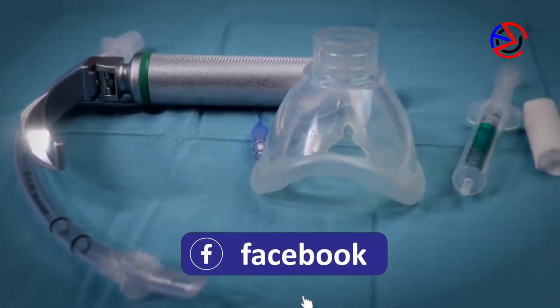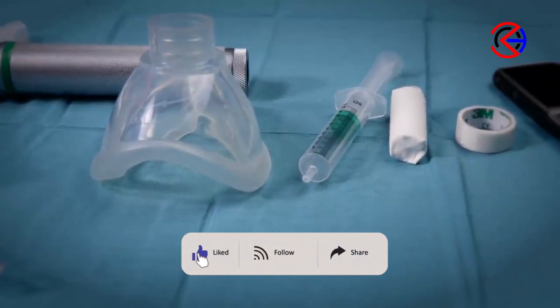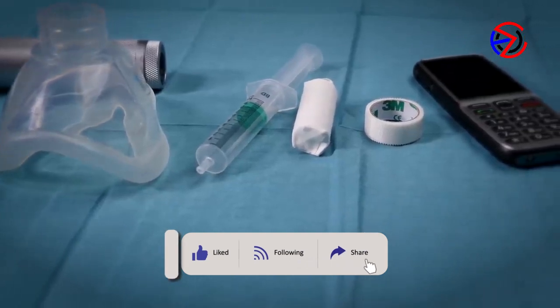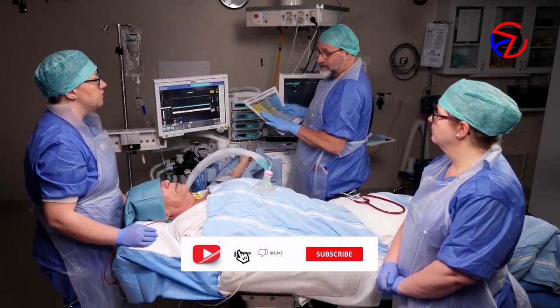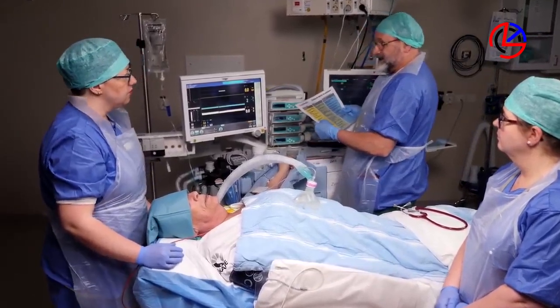It is best learned through practice under expert supervision, in our opinion, first on a mannequin and then on elective, uncomplicated and fasted patients. This lesson aims to prepare you for these practice sessions, and our narrow focus is teaching the manual skills that will increase your chances of success.